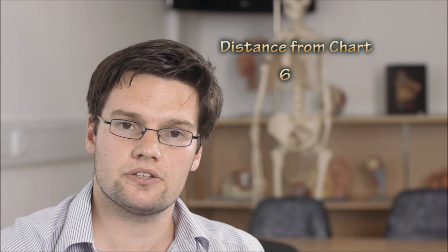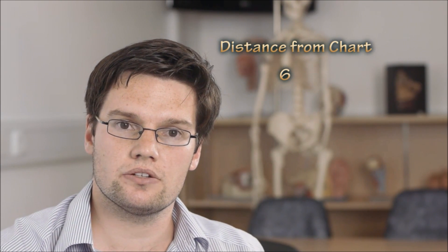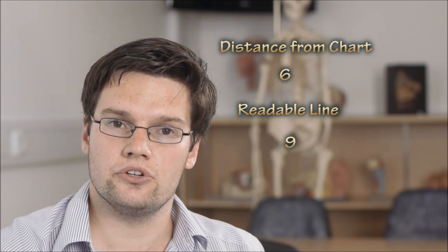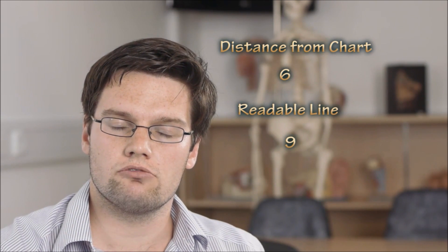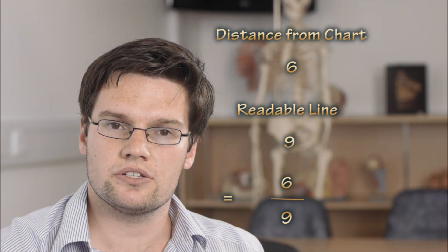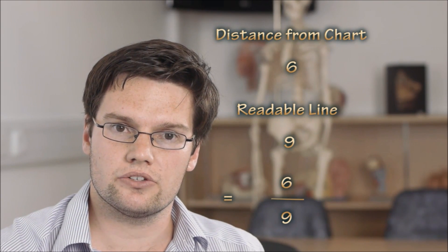This patient can read the line with the number 9 written upon it in both eyes. We will describe this as having a vision of 6 over 9. The 6, the numerator, represents the distance from the chart that the patient was positioned. The number 9, the denominator, represents the line that they would read — this is the distance that people with normal eyesight can read this line from.